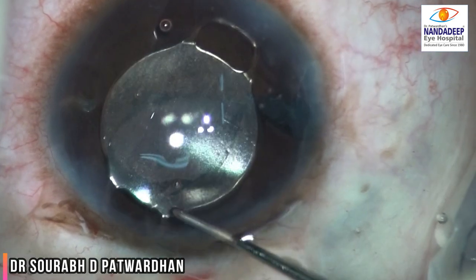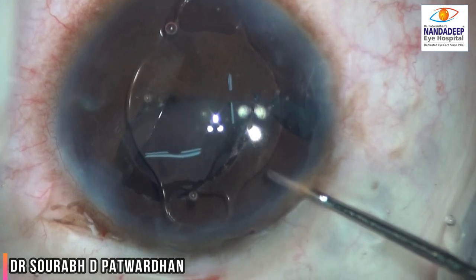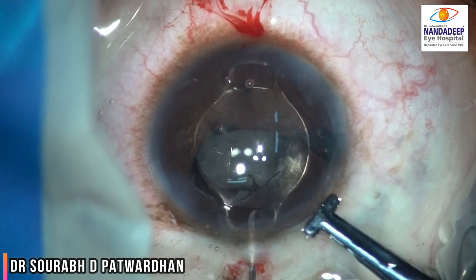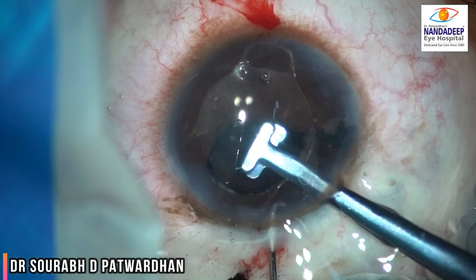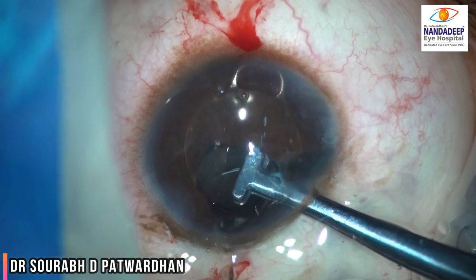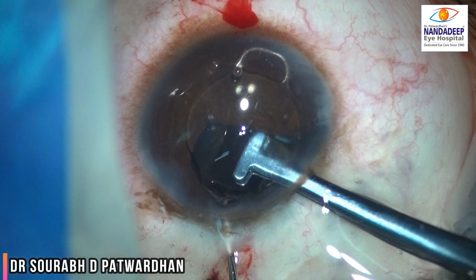I made it oblique because on the nasal side you can see the pupilloplasty was done, so I didn't want to enclave the iris claw in that area. This is the special forceps for holding the iris claw. On the supratemporal aspect, I enclaved it using the Sinsky hook.